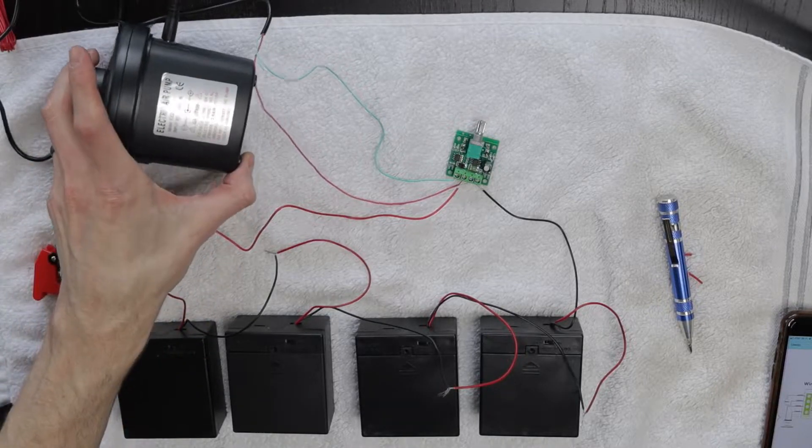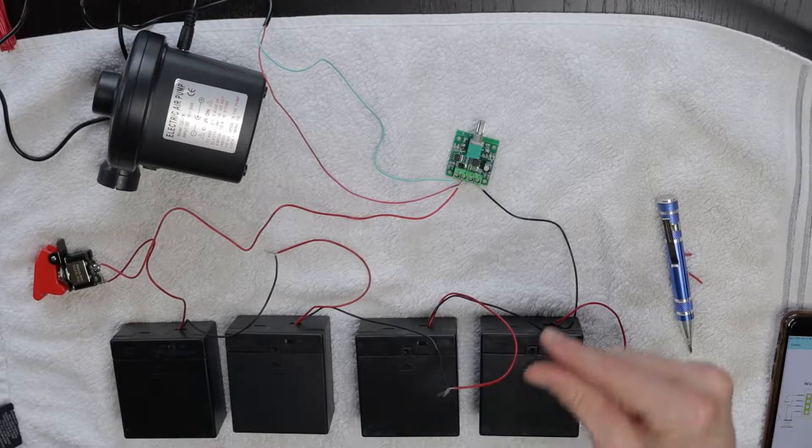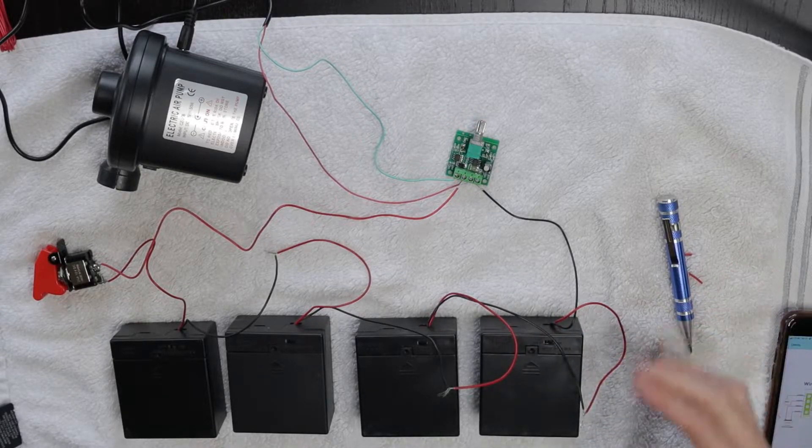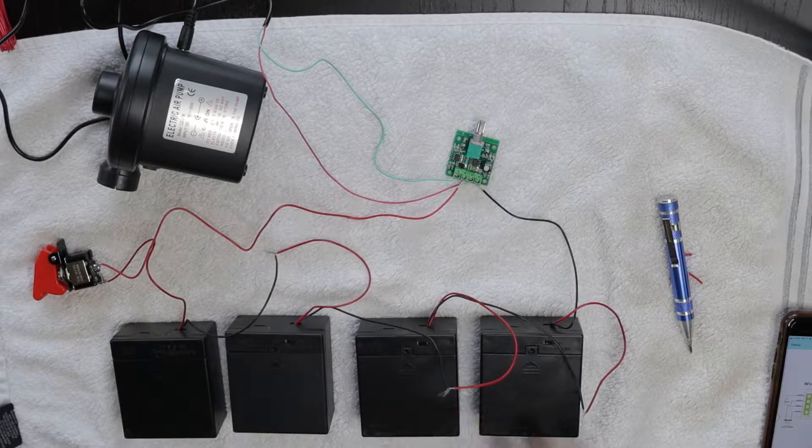Normally when you have a little air pump like this for air mattresses, you turn it on and it's just max power 100% of the time. For this purpose, I don't want that. This is going to be an air respirator device for my 10 month old, so I don't want it cramming air down his throat. I want the ability to turn it down so it's just enough to give him a little airflow to help him breathe through the filter. It'll also keep it quieter and use less power.